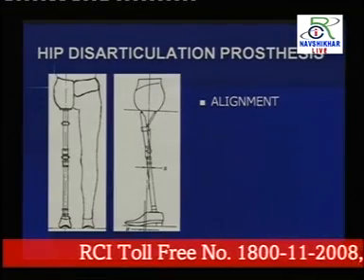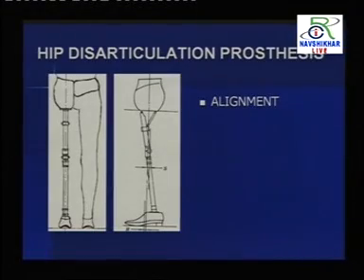She walks without any support, and she's maintaining very even and nice walking. The assembling of this prosthesis, the alignment, is not that easy. It's a very complicated one. See, this is the alignment, and this element, it's very difficult. The placement of the hip joint in this is anterior.